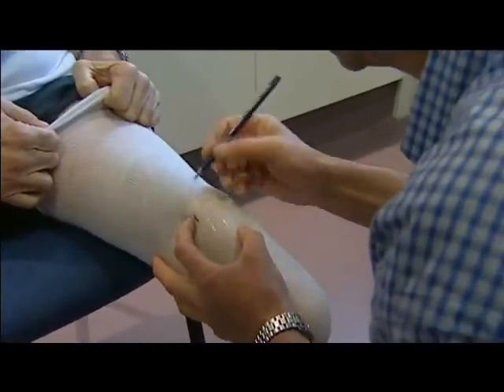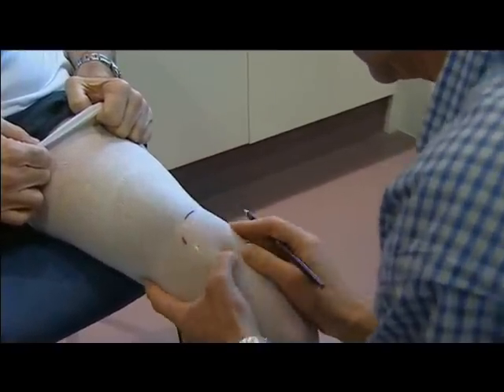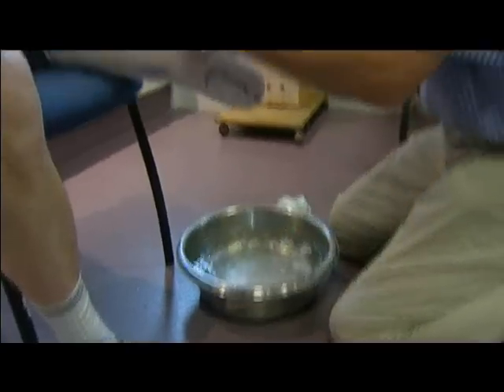After having cling film wrapped around his leg, prosthetics specialist Bill Spence marks the ends of Wallace's bones before putting it all in plaster. It's a rudimentary technique which hasn't changed much in 30 years.